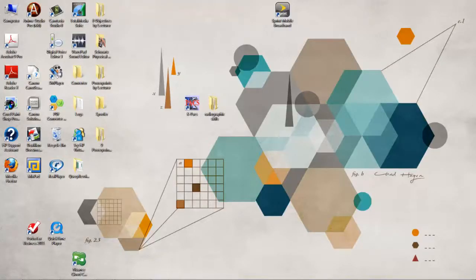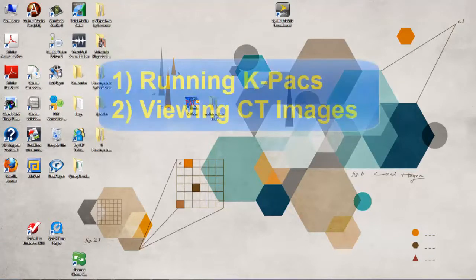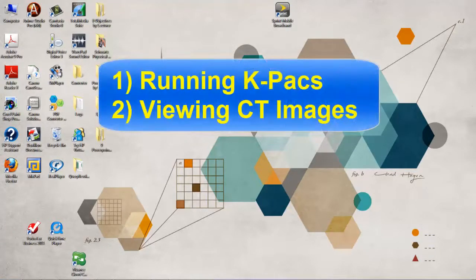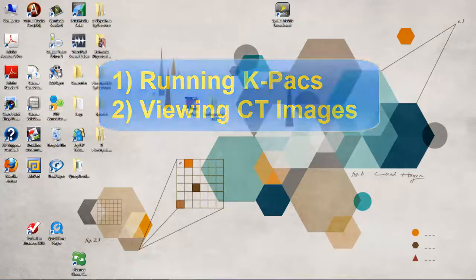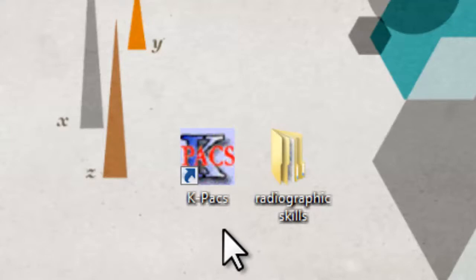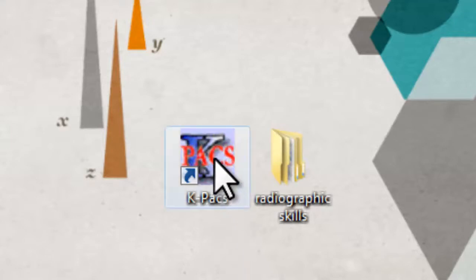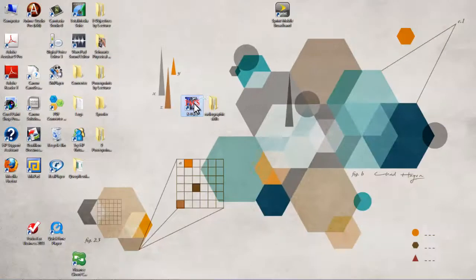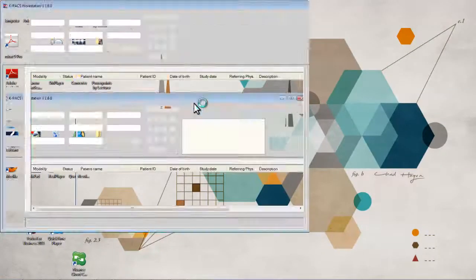Now that we have installed K-Pacs, I want to show you how to run K-Pacs and how to load CT images into K-Pacs for viewing. On my computer, I put K-Pacs right next to my folder Radiographic Skills. This is a shortcut. If I click on this shortcut, K-Pacs will load.